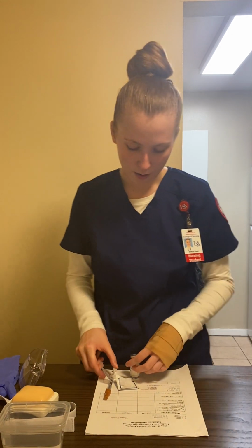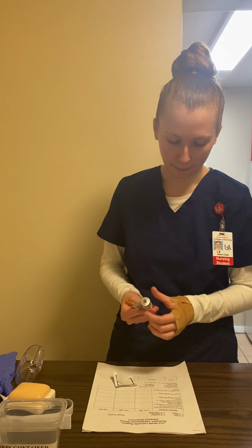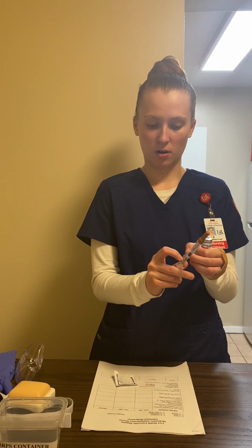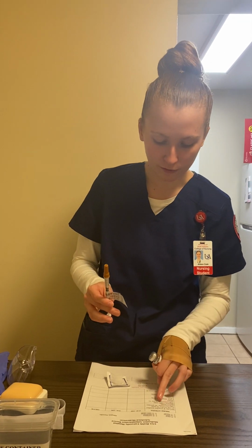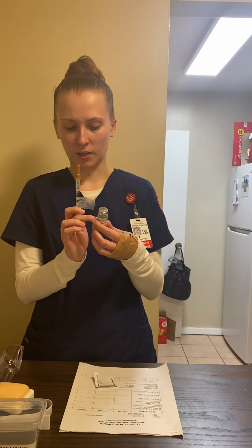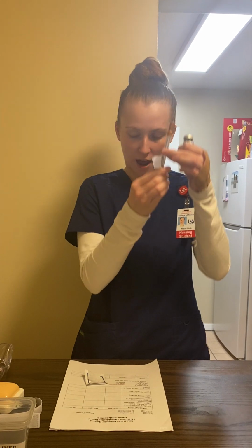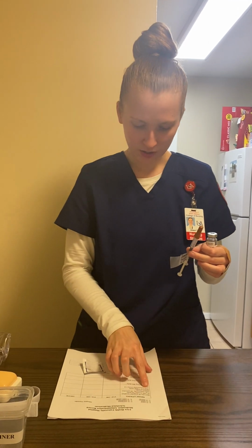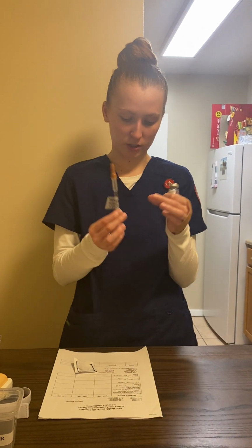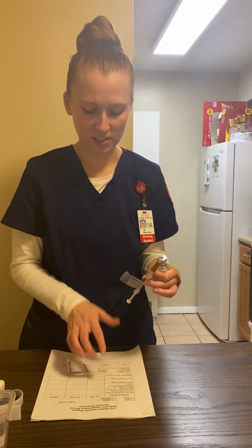And okay, now I'm going to look at the syringe and vial and compare it to the order on the MAR. So we have heparin on the vial, and we have heparin on the label on the syringe. We have 5,000 units. On the vial, it's 10,000 units per milliliter, meaning we would need half a milliliter. And this is half a milliliter. This is a subcutaneous injection, so that is why we are using a tuberculin syringe. This is given every 12 hours.